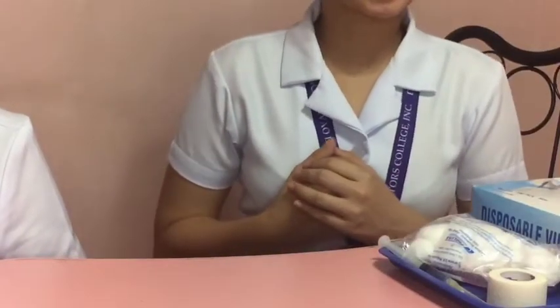So now, let's select a site free from skin lesion, tenderness, swelling, and one that has not been used frequently. If injections are to be given frequently, alternate the sites. Avoid using the same site twice in a row. Locate the exact site for the injection. Before doing so, let me first clean my hands and apply gloves.